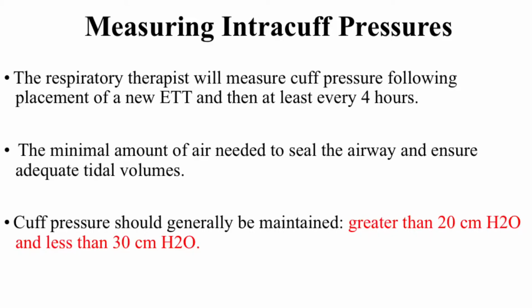Measuring intracuff pressures. The respiratory therapist will measure cuff pressure following placement of a new endotracheal tube and then at least every 4 hours. We generally inflate the cuff with the minimal amount of air needed to seal the airway and ensure adequate tidal volumes. Cuff pressure should generally be maintained greater than 20 centimeters of water and less than 30.